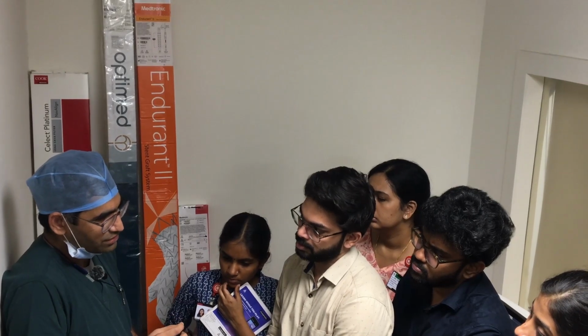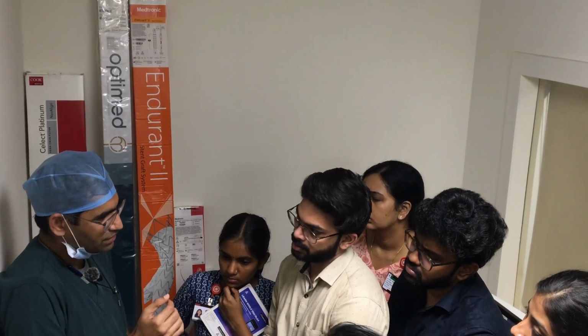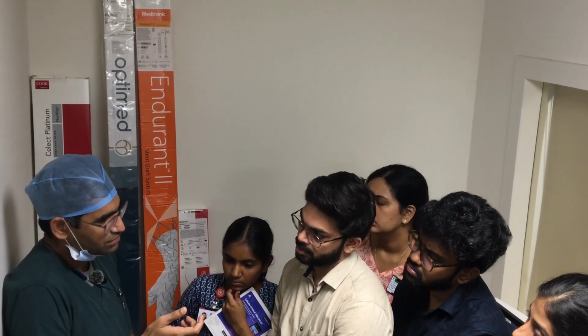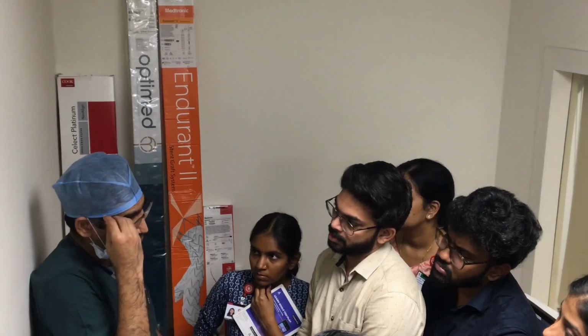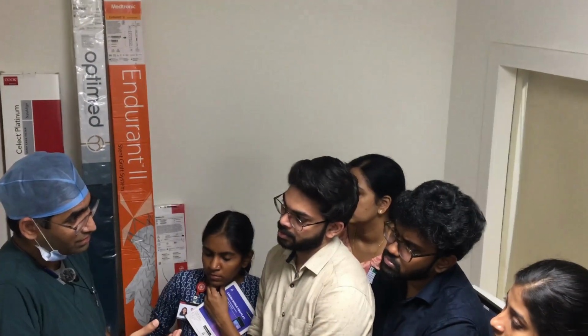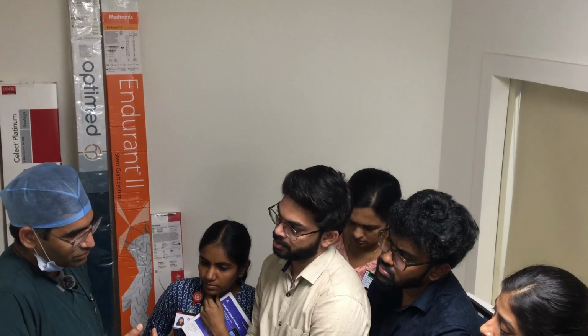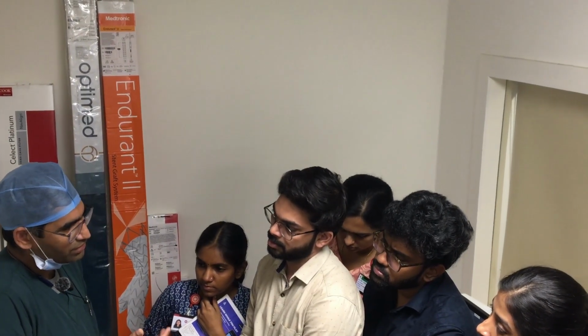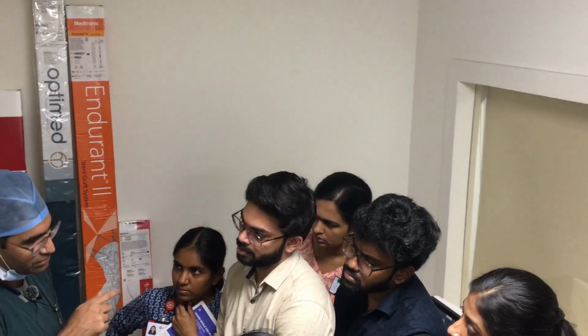What I mean is, when you push, how much the tip buckles. Does it remain straight or does it buckle on the hard lesion? That defines the tip load. There is an experimental way of categorizing the tip load, which is different. So if you have a harder lesion, a calcified lesion, you have to increase the tip load. So when you push outside, the tip will go straight.